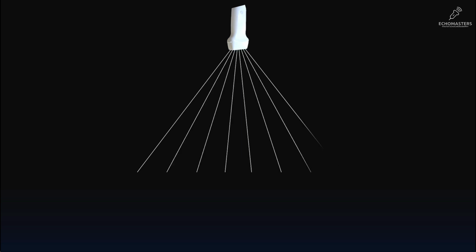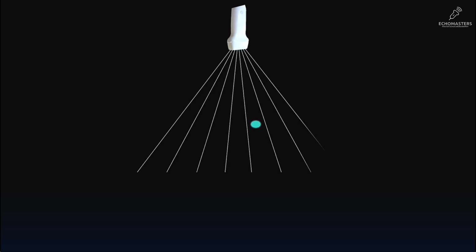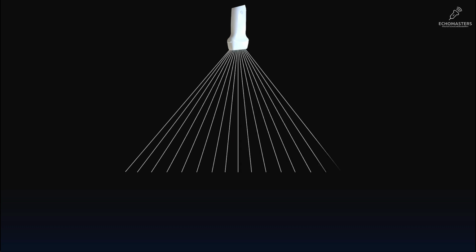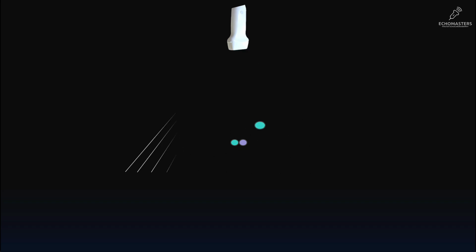If we decrease the line density, the frame rate would improve, and this will give a better chance to capture a moving structure easily. But this will decrease your lateral resolution and your ability to differentiate two objects side by side. This is much better for this mobile structure, because multiple frames per second will be able to track the movement in good time and the motion will be smooth. Your target in each study is to get that balance between lateral and temporal resolution, and it really depends on what question you are trying to answer.